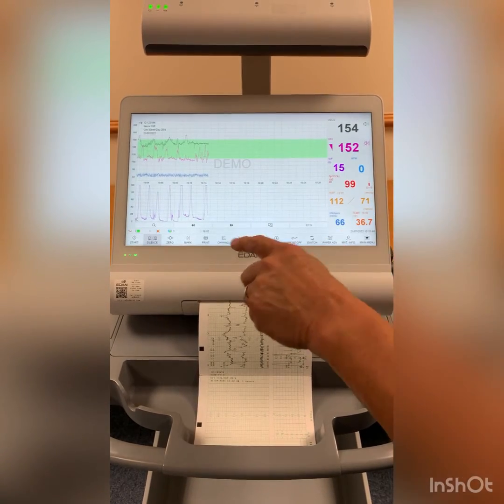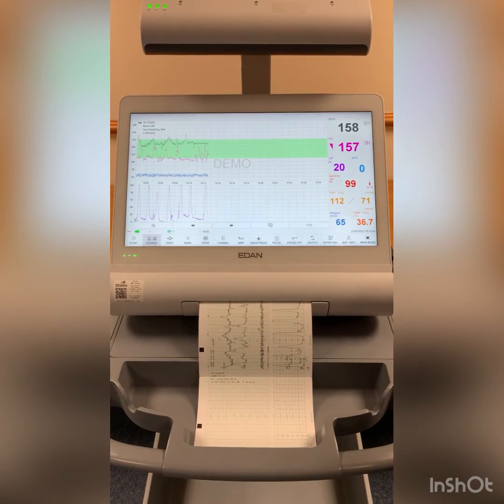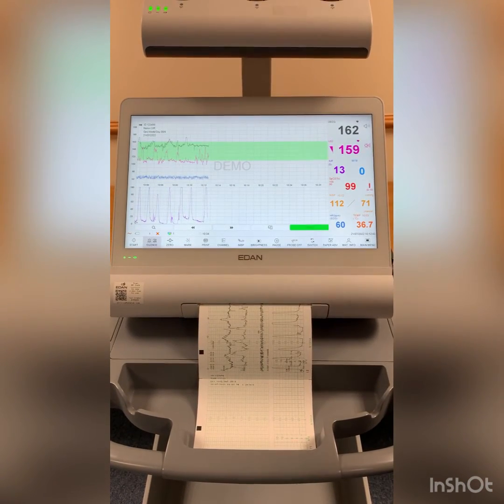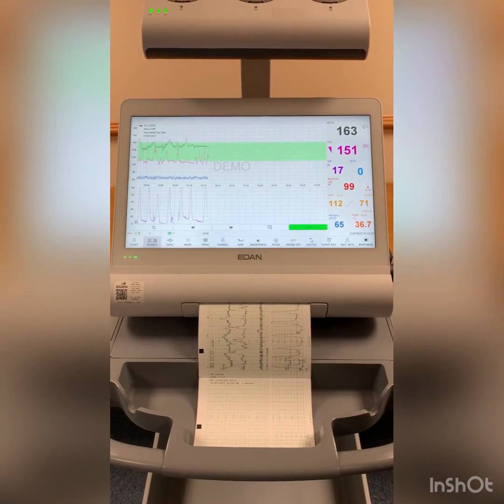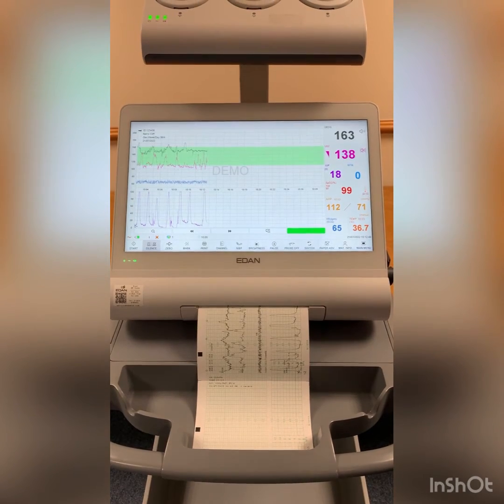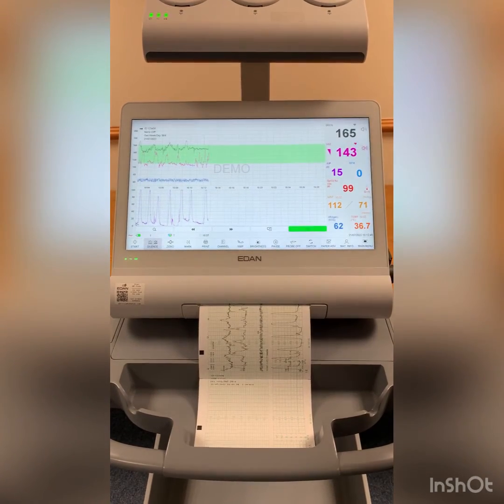We've just gone past the 10 minutes time. There you can hear the beep and see the green button.